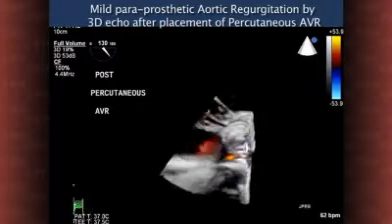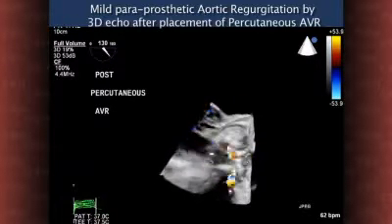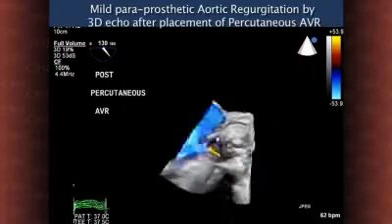And also, the advantage to esophageal echo is that we can immediately see after deployment whether there is under-expansion of the valve and a paravalvular leak present, and not infrequently we'll go on and redilate the valve and get a more symmetrical circular expansion, better sealing. So I think that in terms of positioning, there's been tremendous value, and that has reduced paravalvular leaks because of accurate positioning, and also in terms of the understanding of redilating the valve to get good sealing.